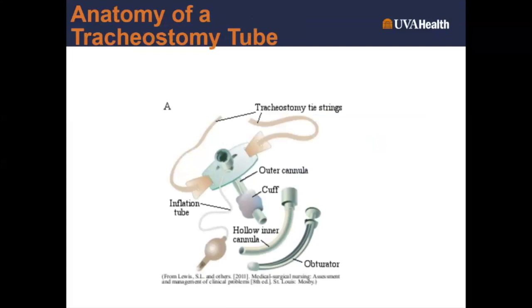Old trachs are metal. And in terms of how to use the trach specifically, because you can see that there are multiple components to it, it's really going to be manufacturer dependent. They all generally work the same. It's just how you would remove the inner and outer cannula.